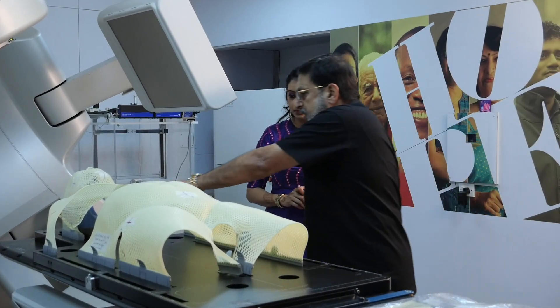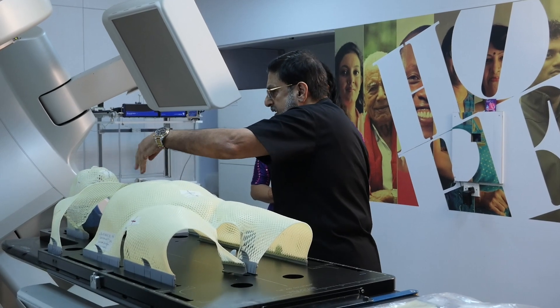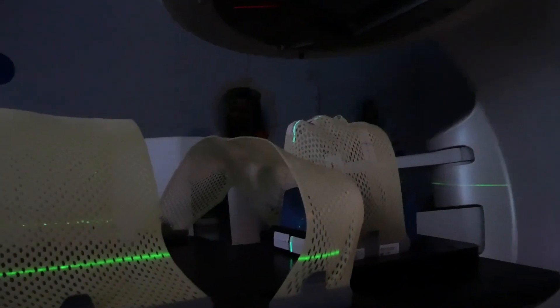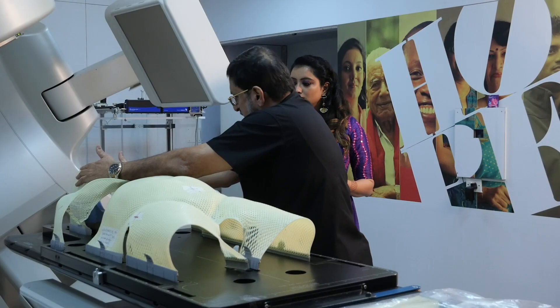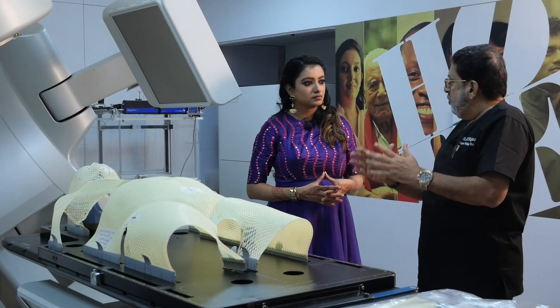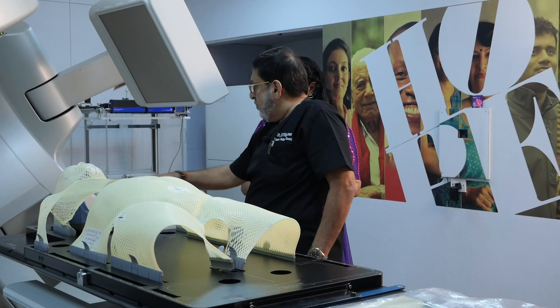We mark with some kind of three points on the patient with all the centers. To align the lasers — we have two lasers on the side and one laser on top — which will align the patient exactly in the position which you are supposed to treat. Once we have aligned the patient, the x-ray emits out and the radiation is delivered.